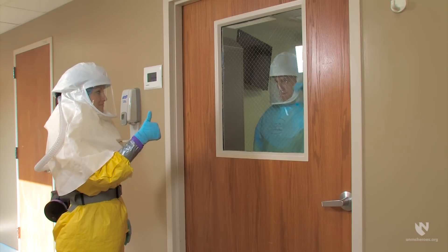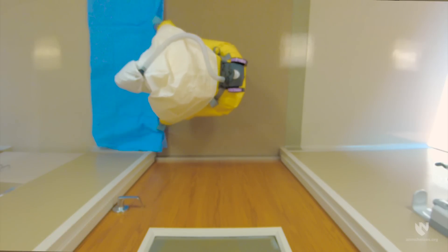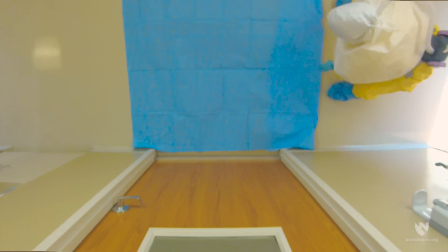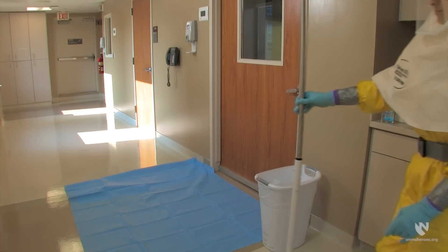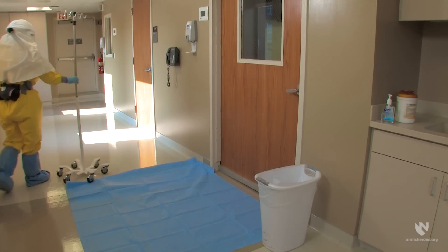The process begins with the healthcare worker alerting the doffing partner that they are ready to leave the patient care room. The doffing partner should then prepare the doffing space by placing a doffing pad on the floor directly outside the patient room door. Next to the doffing pad, place the lined trash container to allow the healthcare worker and doffing partner to discard used PPE as it is removed.